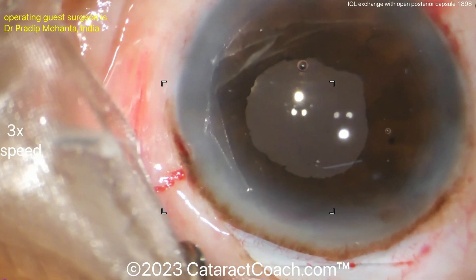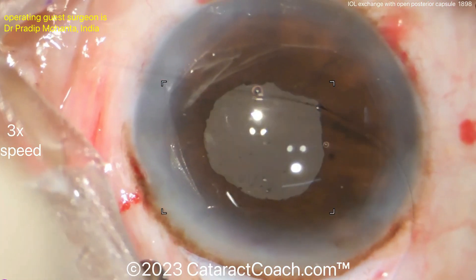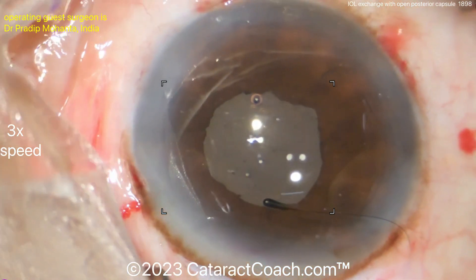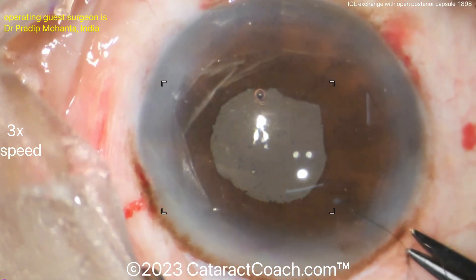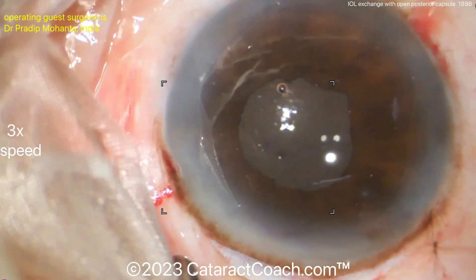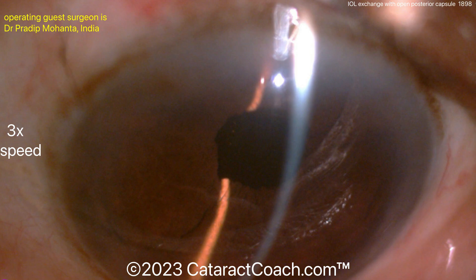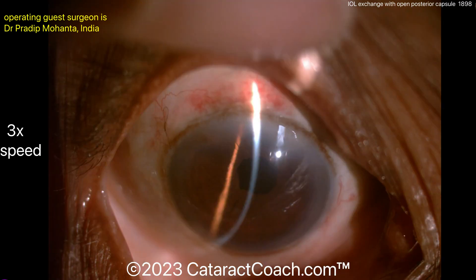The conjunctiva is closed with what appears to be a running suture. Next-day post-op shows a beautiful result. If you have this case, don't worry — you can do it. A well-constructed incision and meticulous technique make all the difference.